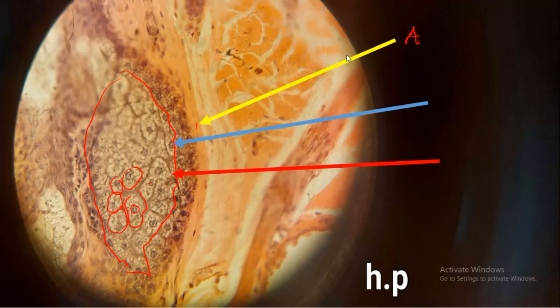In the exam, they can project A and say identify A, project B and say identify B, or project C and say identify C. Like I've said, A is the erector pili muscles, B is the nucleus having the nucleolus, and C is just the cell membrane.